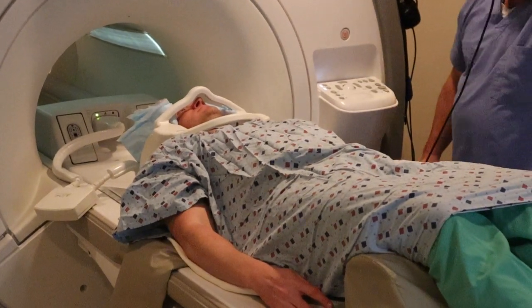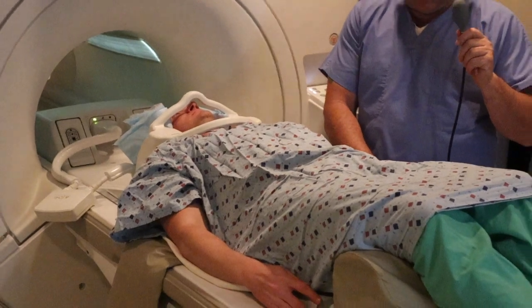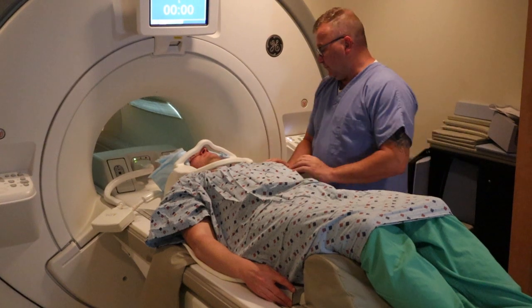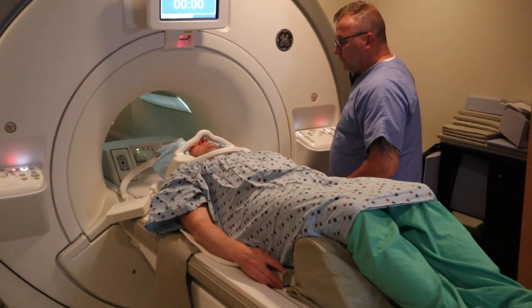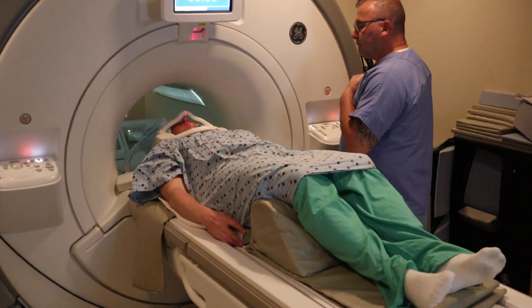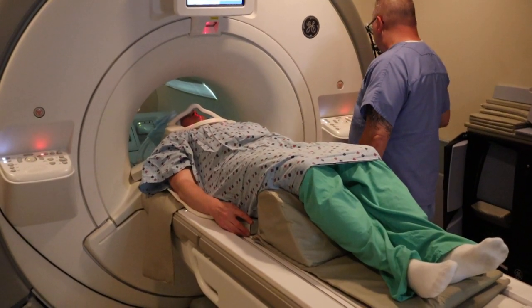If you can't, just provide that other additional piece to connect the signal. Give the patient a panic ball to communicate with the technologist, and your landmark is now going to be around T6-T7. You're going to landmark and then advance to scan.